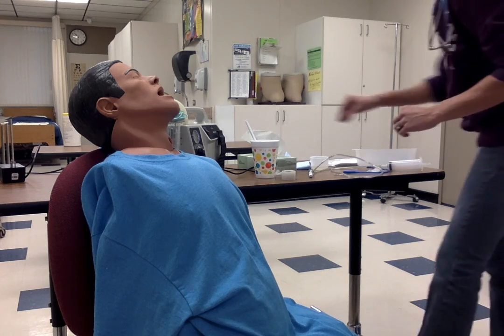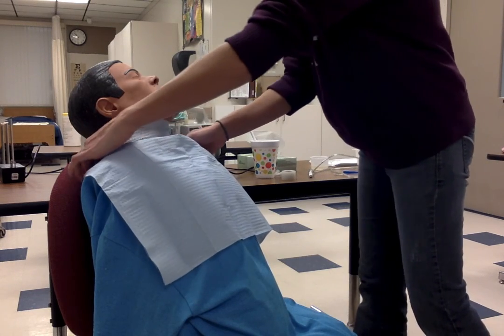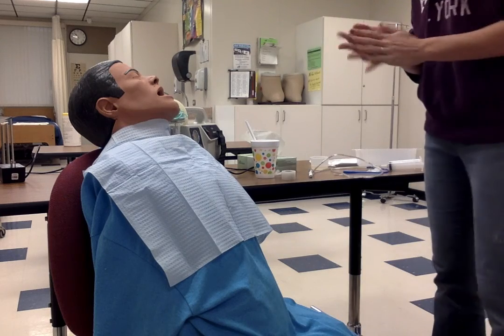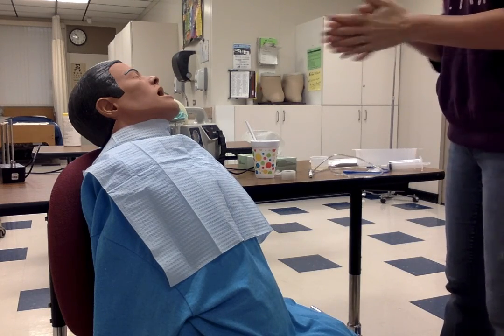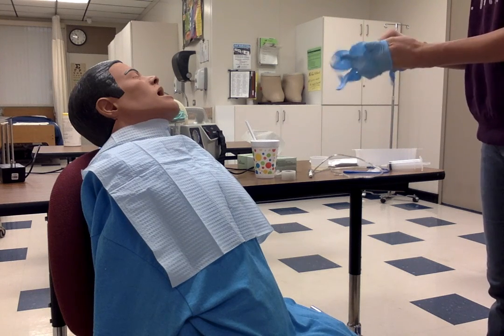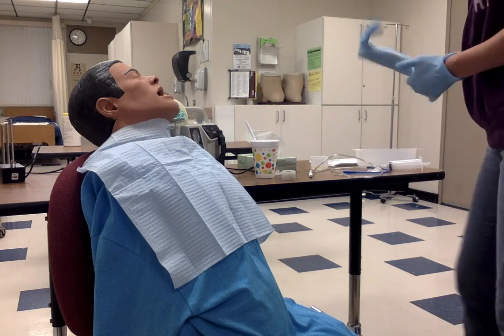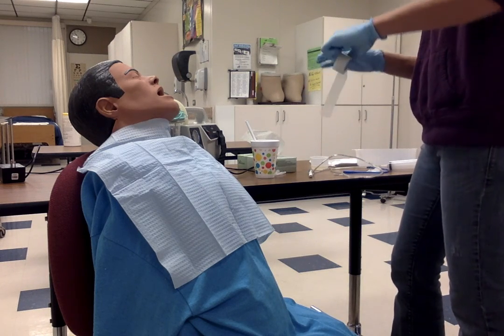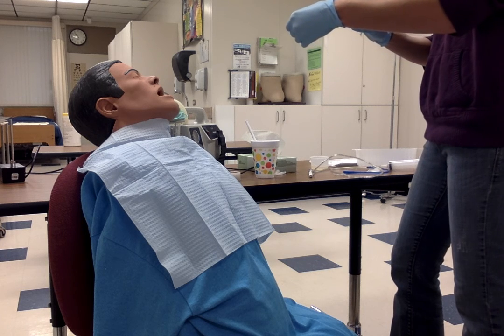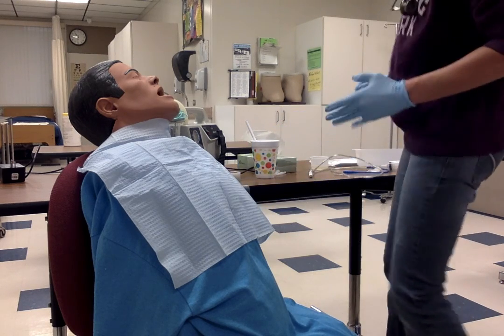So I've got my syringe ready to go. I want to put this over my patient to keep them nice and clean. There we go. All right, so you do want to wear gloves for this procedure. You may be coming in contact with some contents that are coming out, or saliva from the mouth. So you always want to wear gloves for this. I also would want to have a piece of tape ready to go once I have it in. So I'm going to go ahead and split this in half. That way I can secure the tube once we have it in his nostrils.